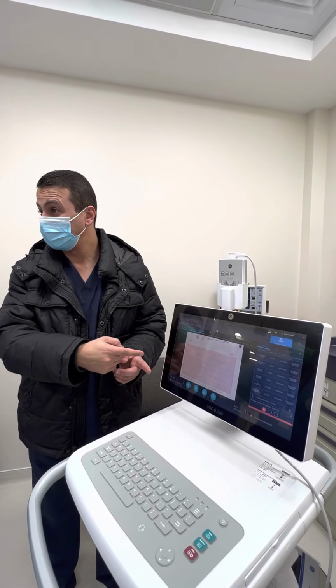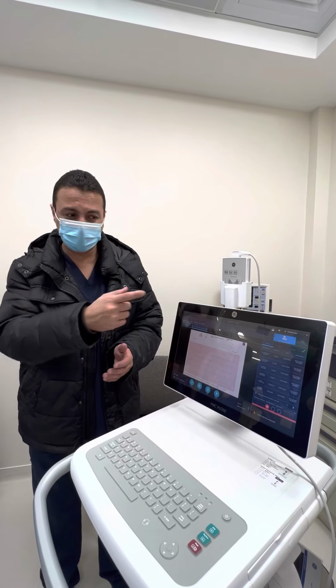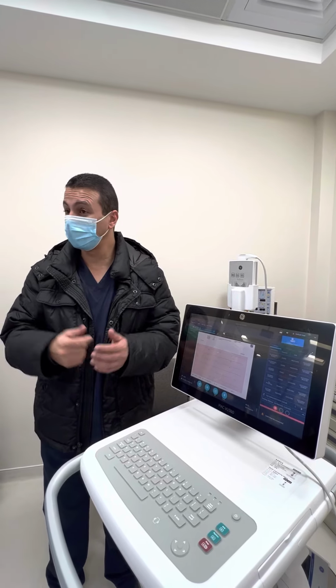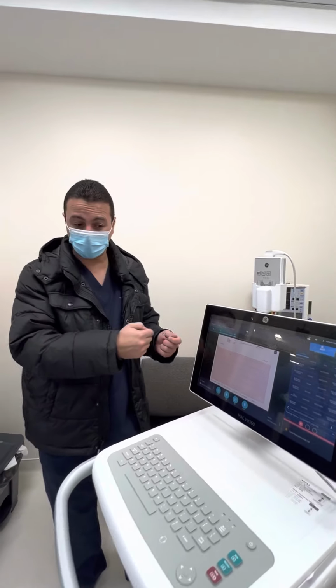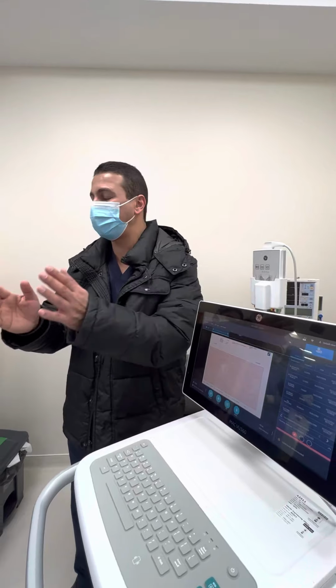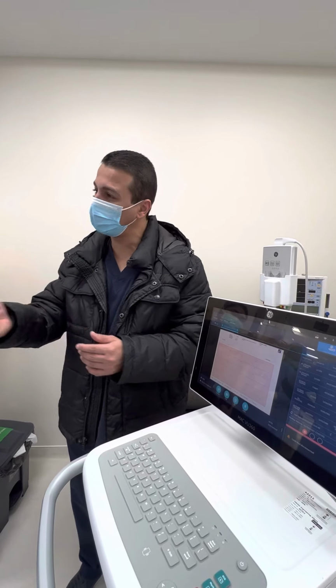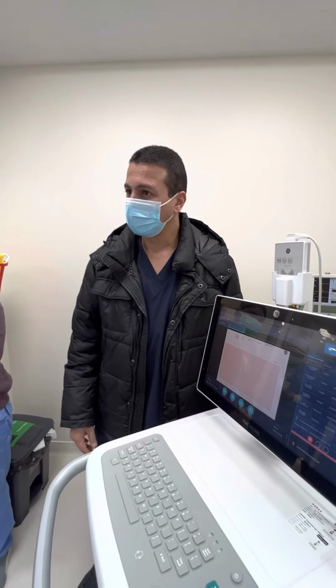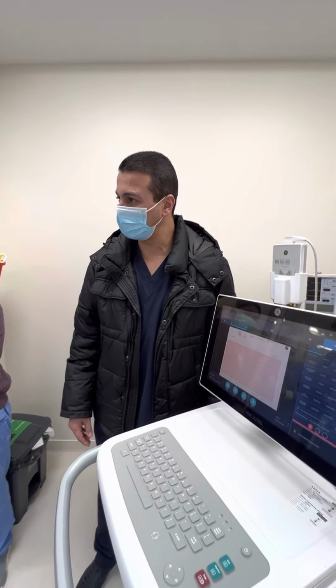It will be better. Yes. How do you open that? From the settings actually, so I will turn it on for you. Oh yeah, better. Okay? So an auto ECG will run. So it's going to be the same picture. The machine will acquire automatically, then you have to accept or reject. If you reject, you will do it manually if you didn't like the picture. Yes. So it's one of the new features as well in the software.